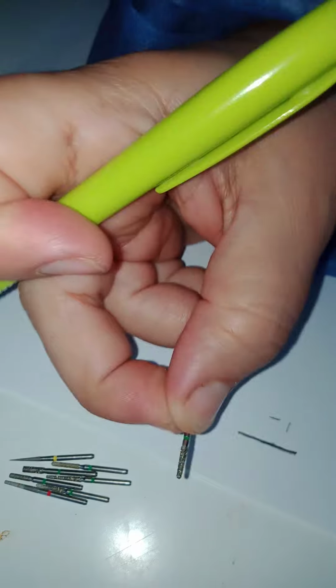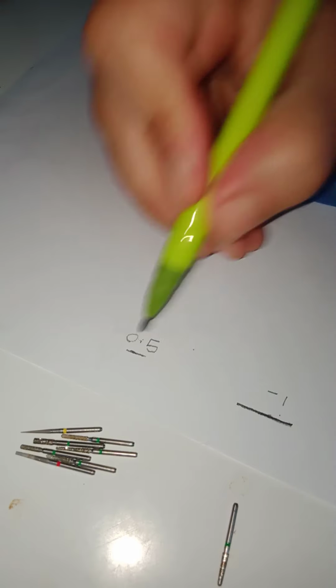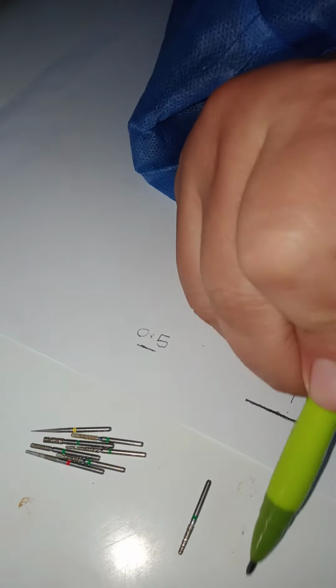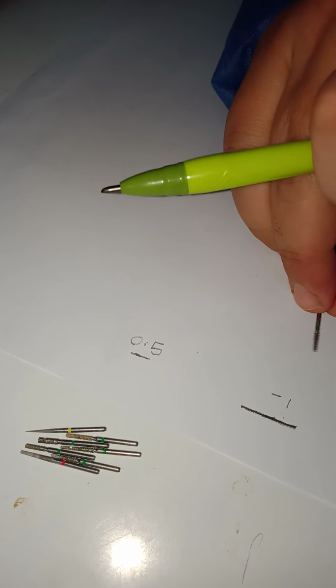Okay. Now, how am I going to gauge this clinically? The easiest way is to know the thickness of your bur. Once more, if I want to create this or this, I could use any of these burs. First of all, I could use any of the burs. Second, I need to gauge how much I'm going in. We first begin with the coarse. I could use the black first and then use the green. Some people go to the green immediately. And I begin preparing. But once I want to prepare, I need to know the thickness of this bur.